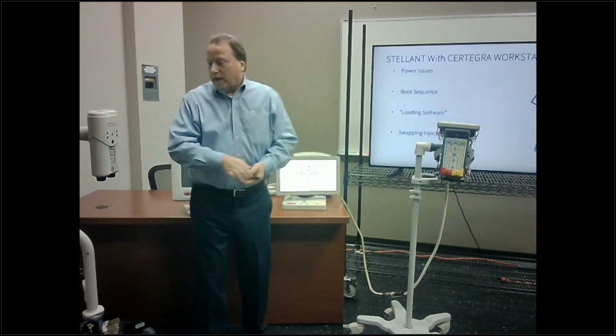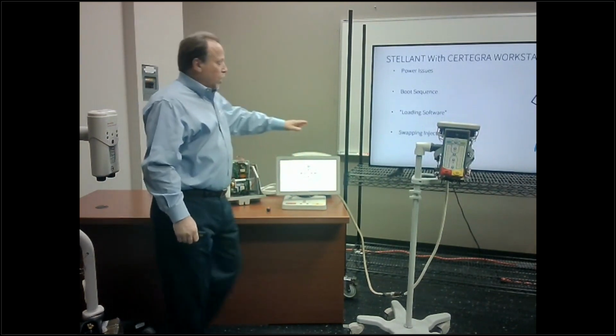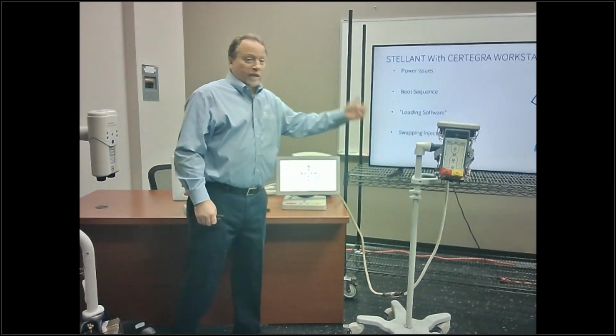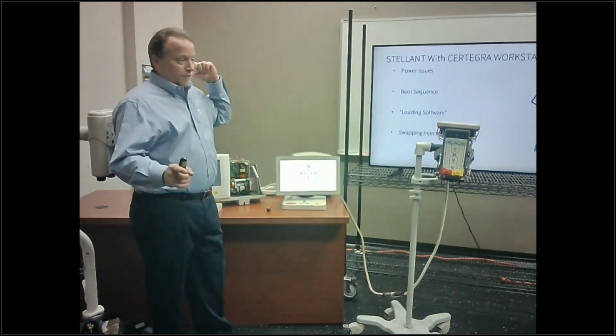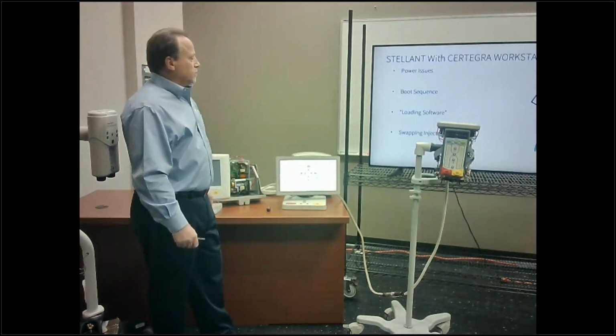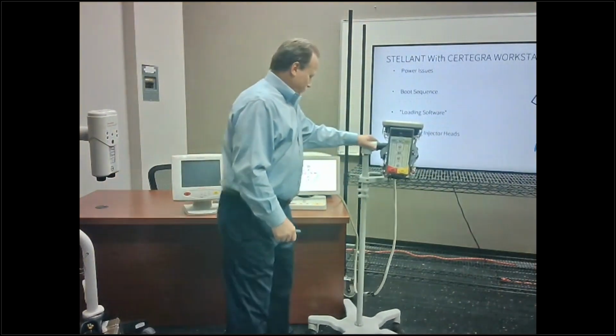Don't take a head from the legacy and put it onto a Certegra. The Certegra will download software to it, and you can't take it back to the legacy. Keep that in mind. The sequence on this is very, very important.